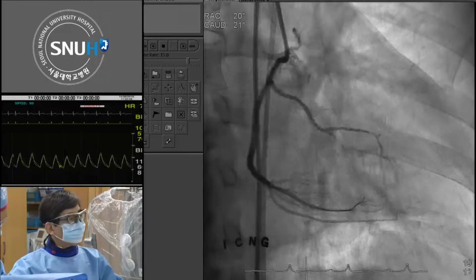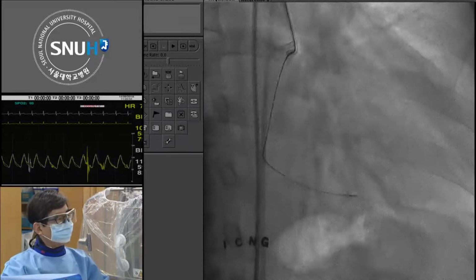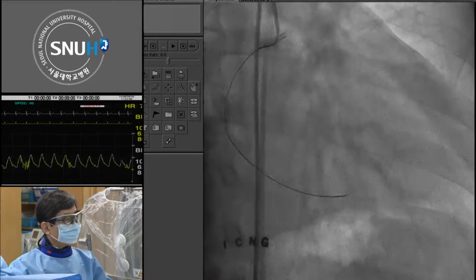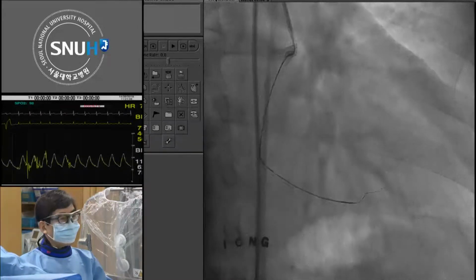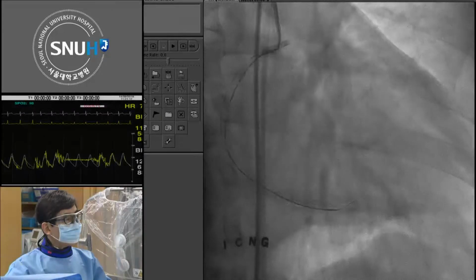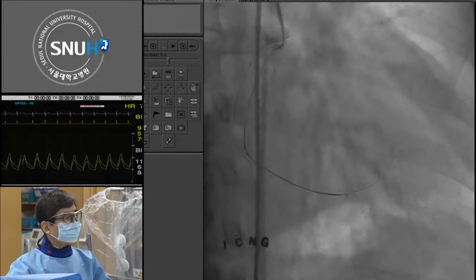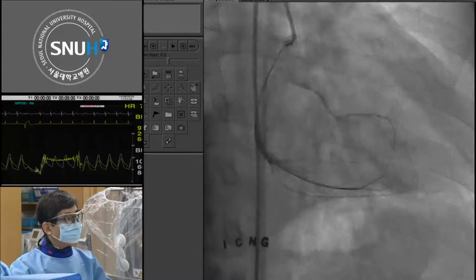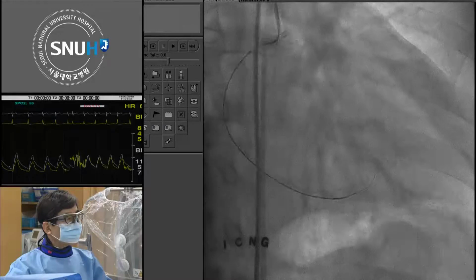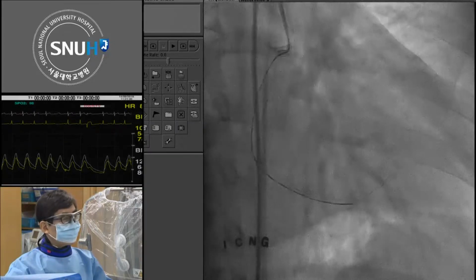You see, he's out of this. It just started. Side branches. That is good. Another septal. That is a different one. If you doubt that channel, tip injection is better.